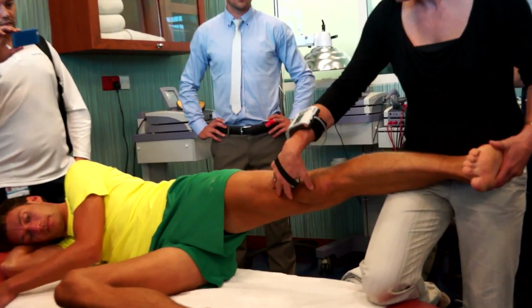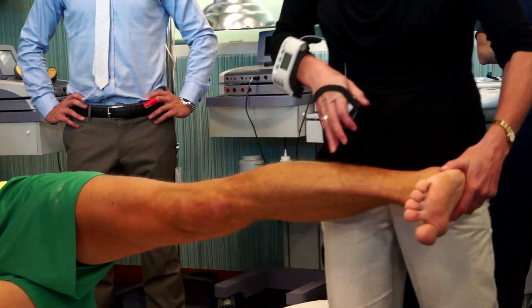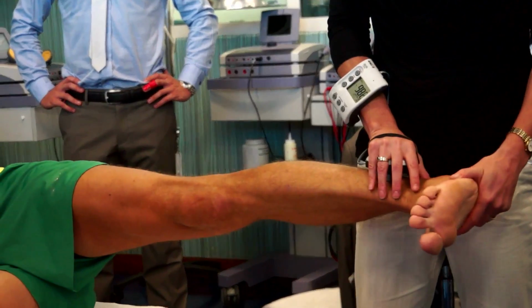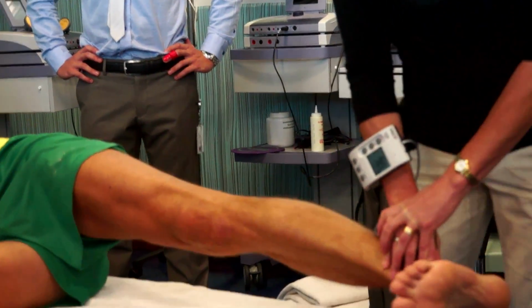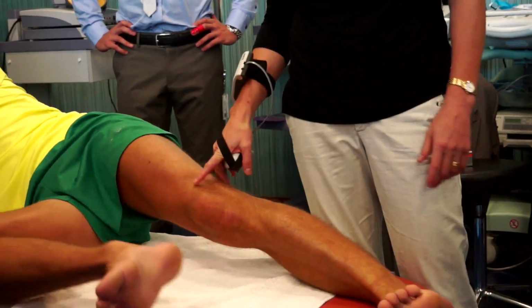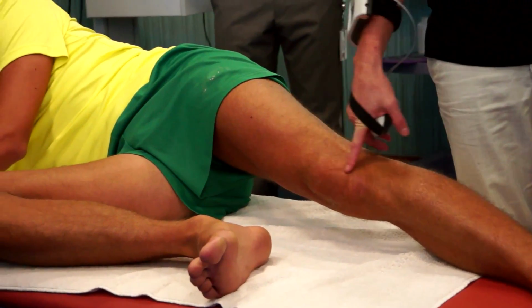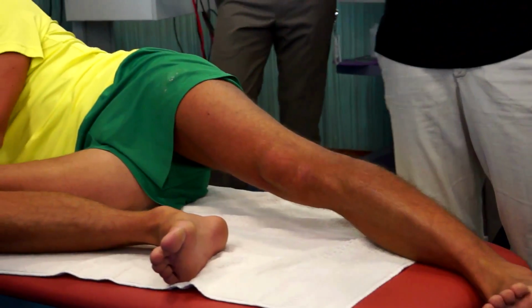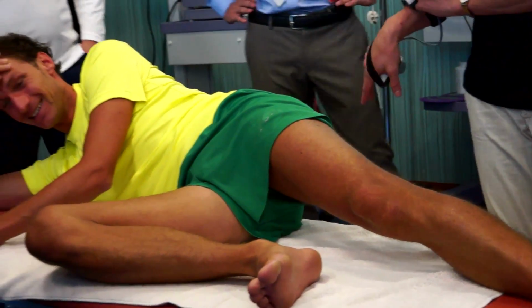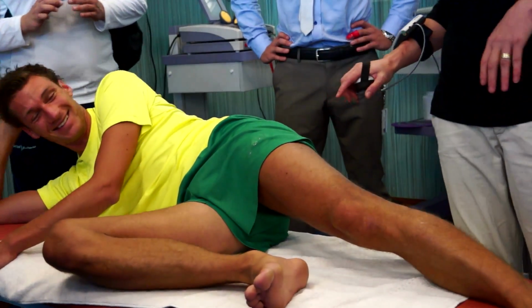So lock your knee for me. And we had our mark here. Go ahead. Push, push, push, push, push. So you could see there, Robert Young's done this test lots of times, but he forgot to keep his knee straight, and he's trying to cheat and produce greater force. It's not very high, by the way. But that was a practice, so it's okay.